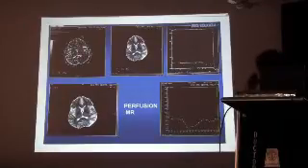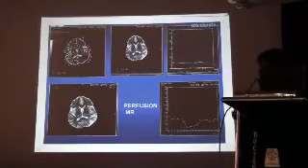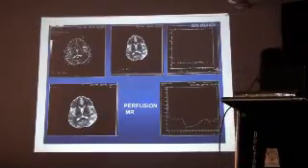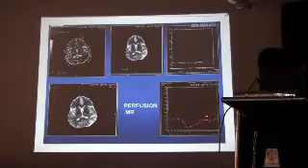But still, sometimes you do perfusion MR. Normally, the perfusion curve is like this. After giving contrast, we do sequential imaging and we go for a mapping like this. But if there is a perfusion defect, we get this type of picture. So there is less blood supply to this one.